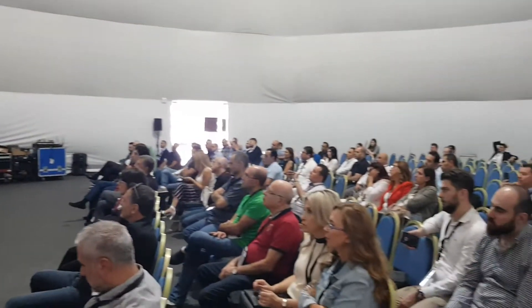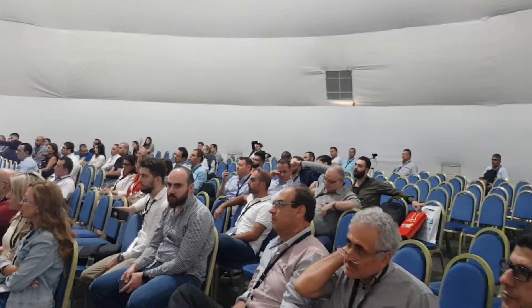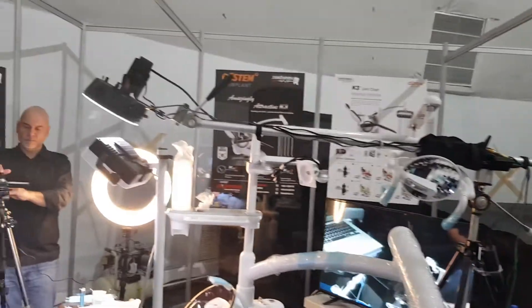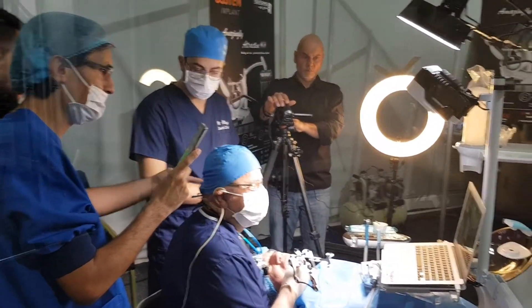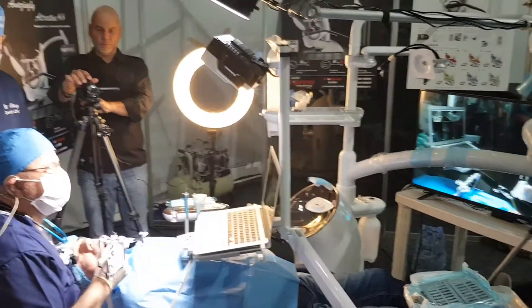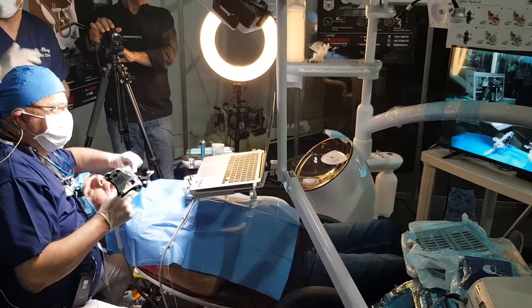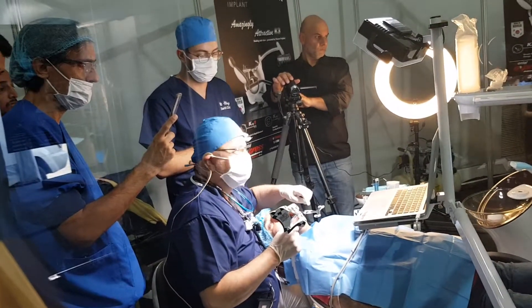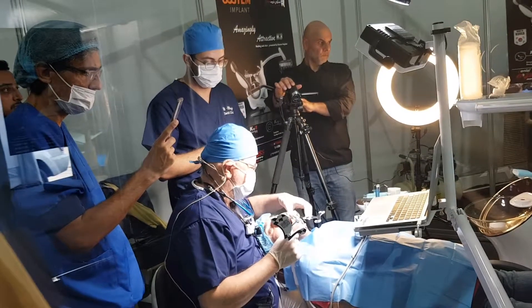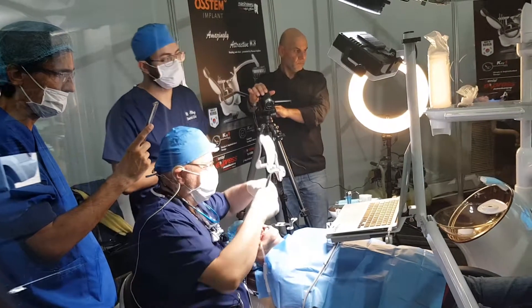After that, it is the tracer. I register my patient. As you see now, nothing is in the mouth of the patient. Three minutes to work. It is the stand connected to the patient — the tracer connected to the patient mouth. But no stand in it, nothing. So we are free to work as we want.